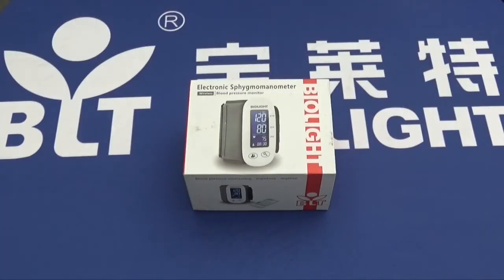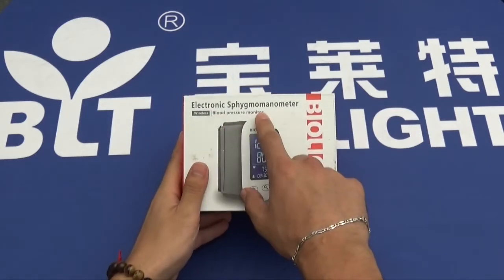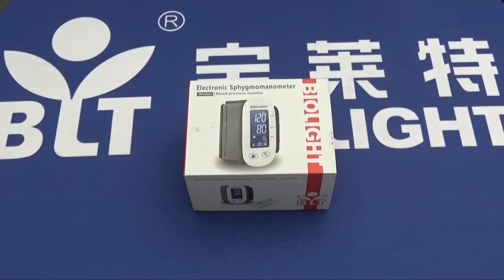Hello and welcome to the introduction and unboxing of the electronic sphygmomanometer by BioLite. It's a wireless blood pressure monitor and its features include an ergonomic portable design, fast measurement time of between 20 and 120 seconds, compatibility with Bluetooth 4.0, low power consumption, and two options of battery: either a rechargeable lithium-ion battery with a charge time under two hours and an operating time above 24 hours, or an alkaline battery.